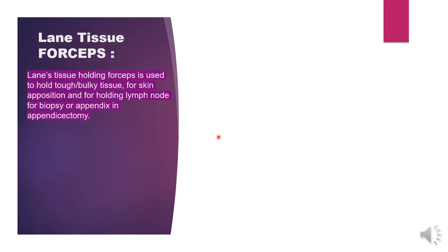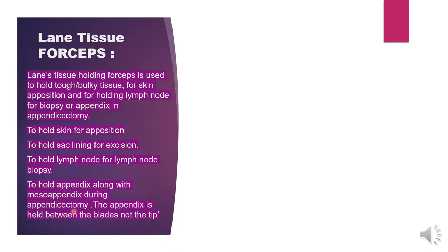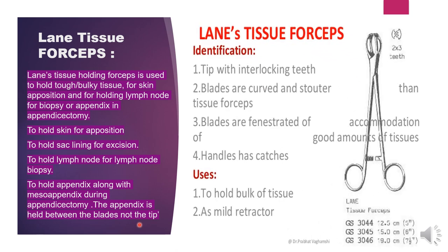Next is Lane tissue forceps. Lane tissue forceps is a tissue holding forcep used to hold tough bulky tissue for skin apposition, for holding lymph nodes for biopsy, and for holding the appendix in appendicectomy. It is also used to hold the skin for apposition and the sac lining for excision. During appendicectomy, the appendix is held between the blades, not the tip. The blades are curved and stouter, with a catch-lock mechanism on the handles.